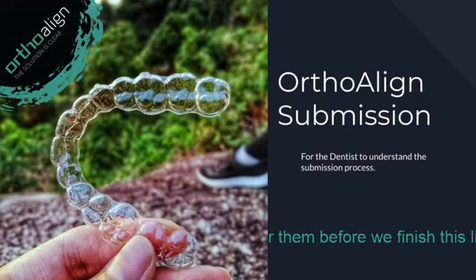For example, by submitting all the necessary information like the photos, the x-rays, and the RX forms, these are all the bare minimum for our orthodontist to assess and give an orthodontic review. So it is very important to make sure that you submit these. It is important as well to note that please do not submit photos like this, because these are not very clear photos of the patient's situation of the dentition.